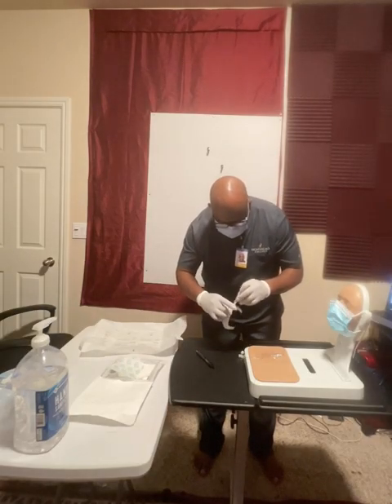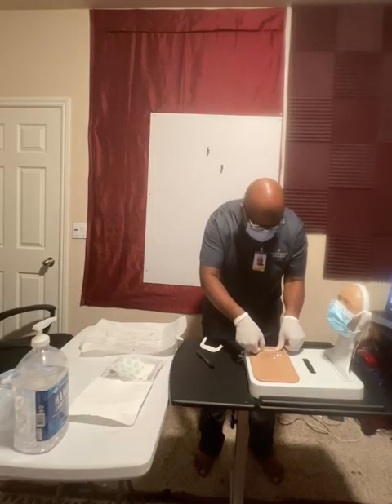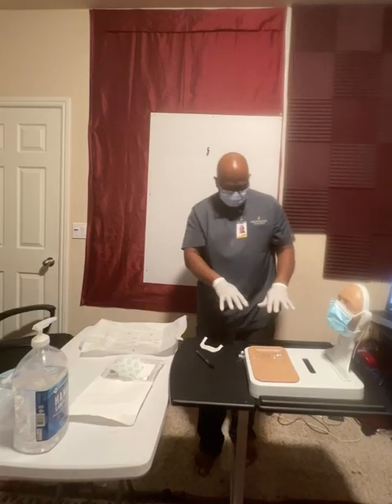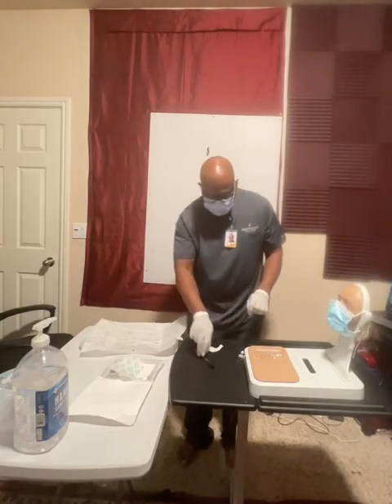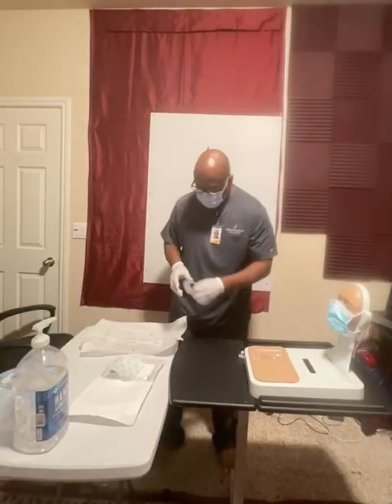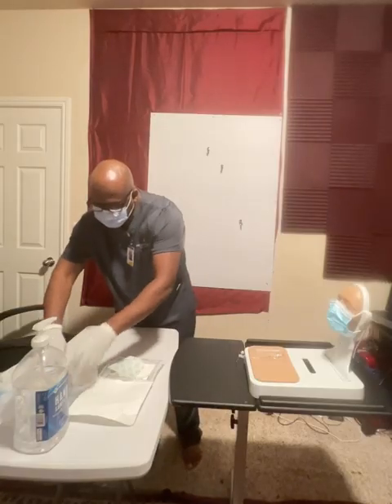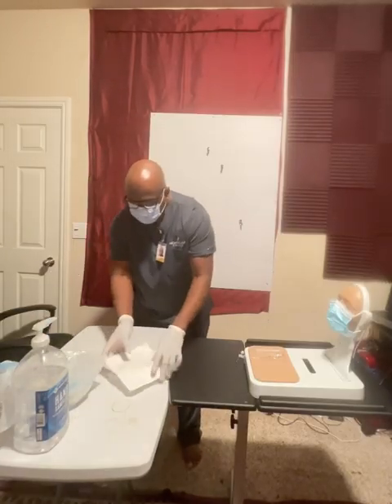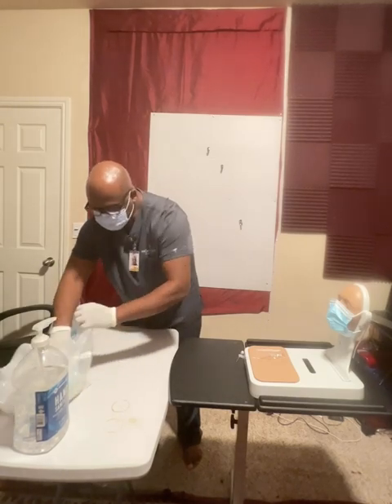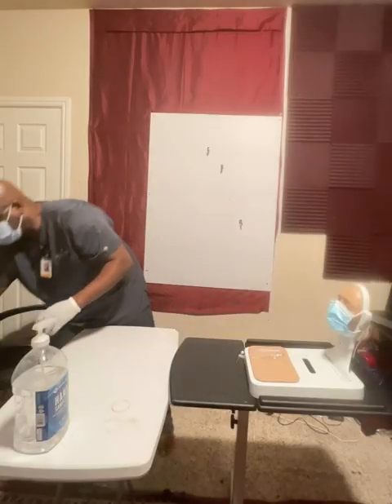Let's take this tape off. Good. We're going to put it along the edge of the transparent dressing because we don't want to cover up the site. We want to always have visual of that site. Then we're going to take this disposable pen and get rid of that. We want to clean up and put everything in the trash bag. Put that trash over here in the trash can.